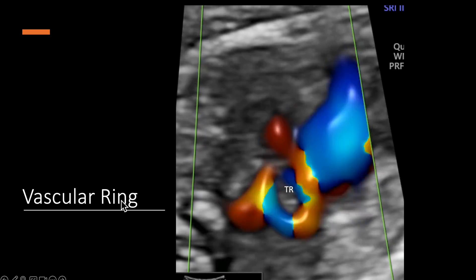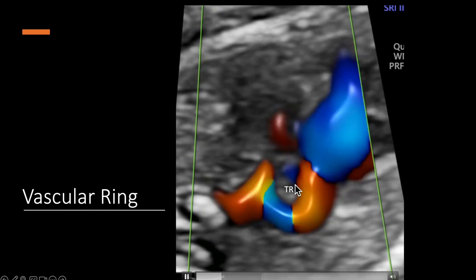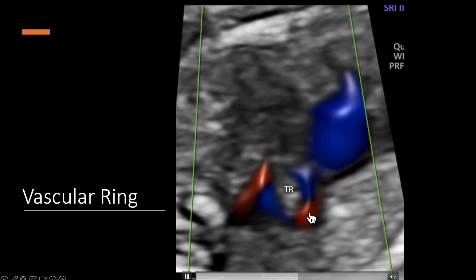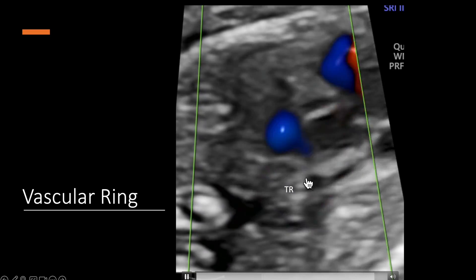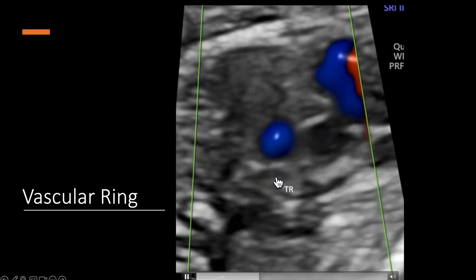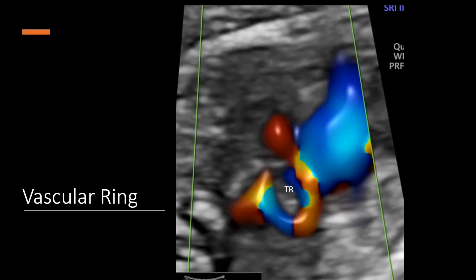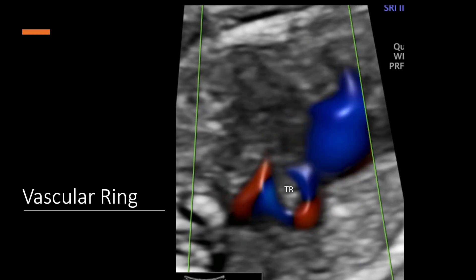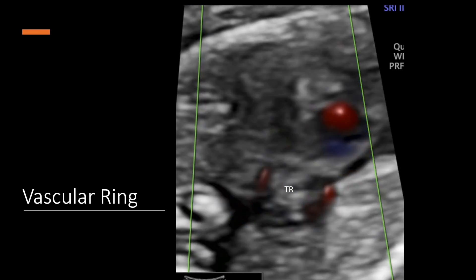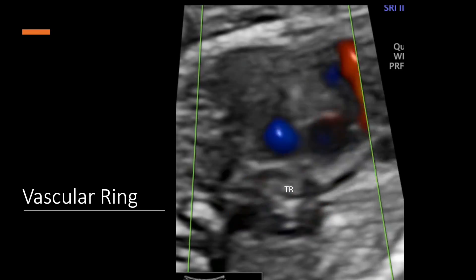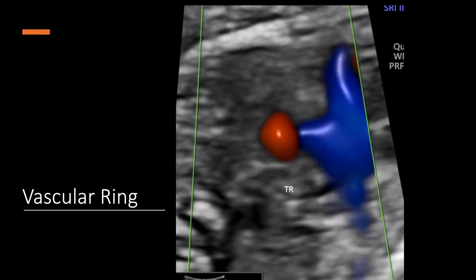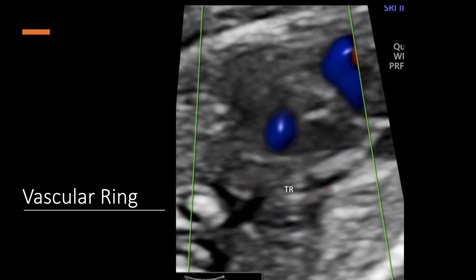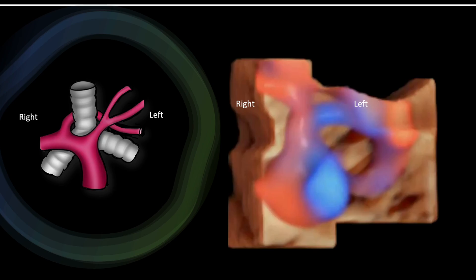Now you see the trachea right in the middle and there is a vascular ring forming — an artery all around the trachea. If you have a vessel encircling the trachea, this is called a vascular ring. There are various types of vascular rings, and I am going to show you a very uncommon and extremely rare one: a pulmonary artery vascular ring.